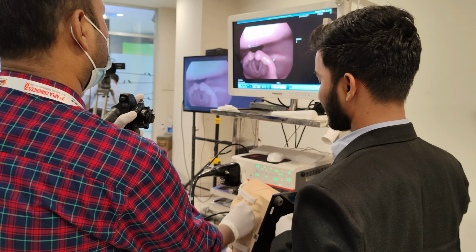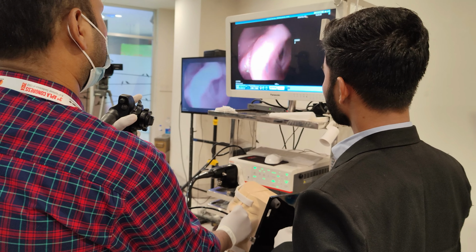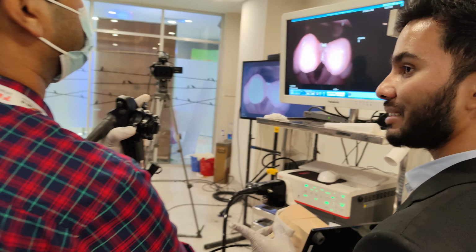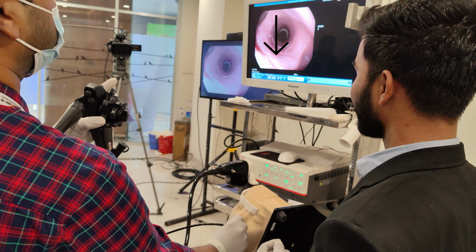Then we have to advance it into the hypopharynx through the postcricoid region. This is the most difficult portion of the procedure. This is the arytenoid cartilage. This is the postcricoid region. This is the posterior pharyngeal wall.